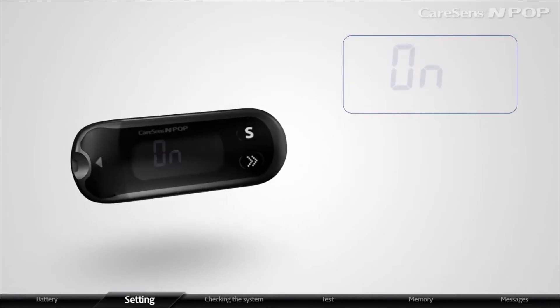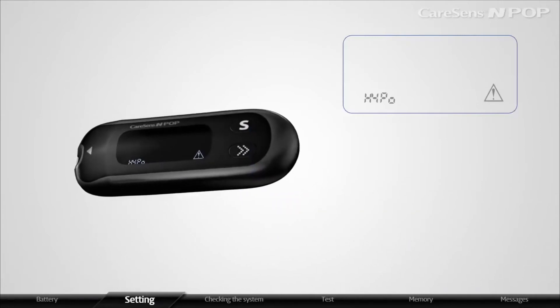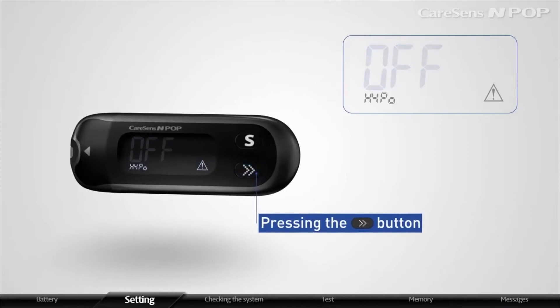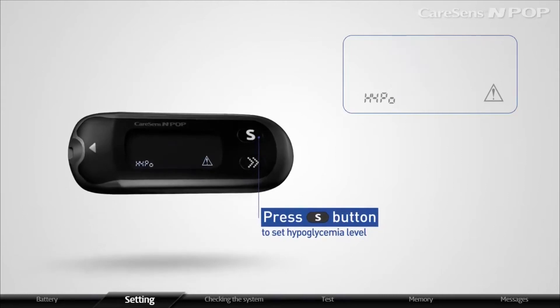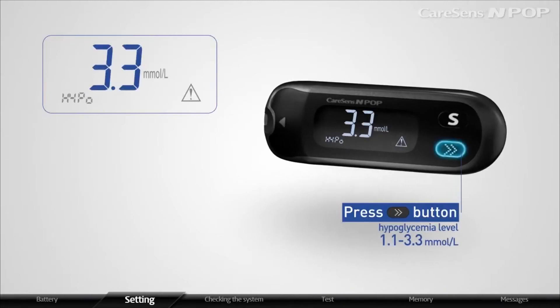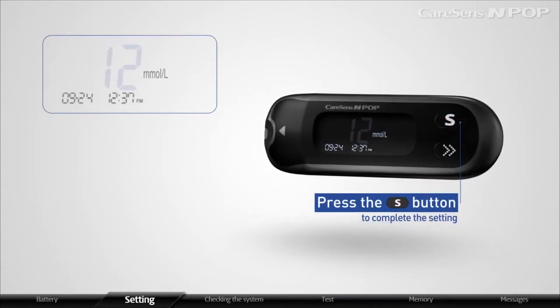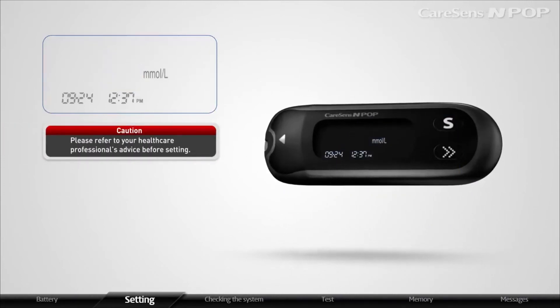After setting the strip expiration date indicator function, press the S button to set the hypoglycemia indicator function. The meter will display hypo and the hypoglycemia icon. Press the arrow button to display on or off. When ON appears on the display, press the S button to set the hypoglycemia level. Press the arrow button to set an appropriate hypoglycemia level within the range of 1.1 to 3.3 mmol/L. Press the S button to complete the setting. Please refer to your healthcare professional's advice before setting the hypoglycemia level.